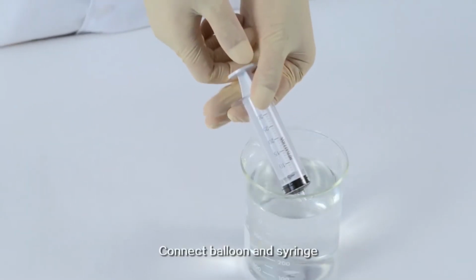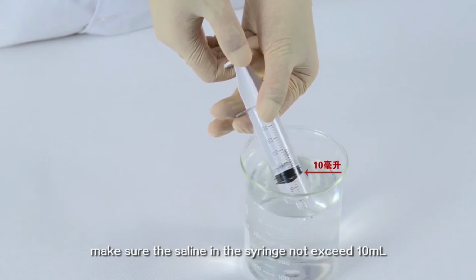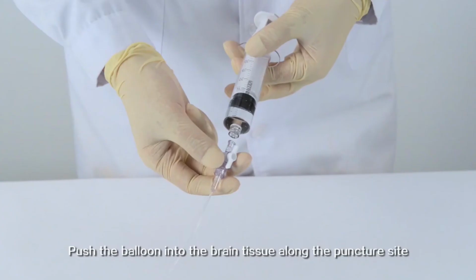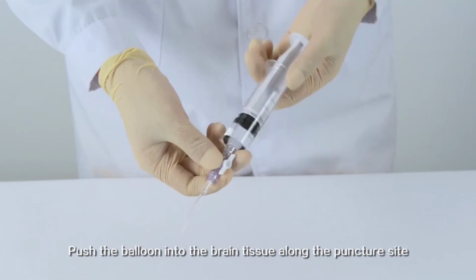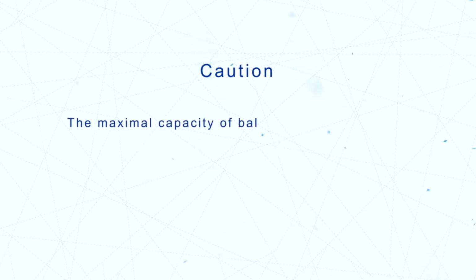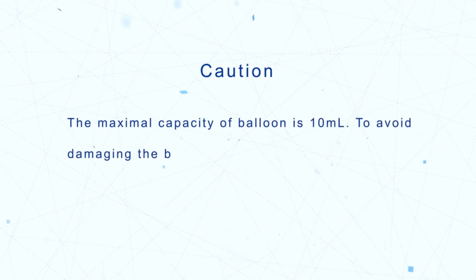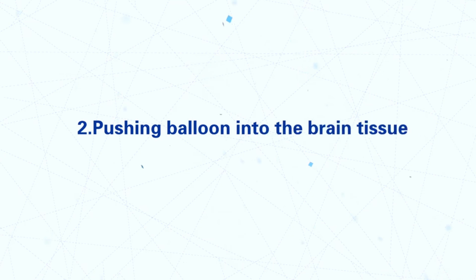Connect balloon and syringe. Make sure the saline in the syringe does not exceed 10 ml. Push the balloon into the brain tissue along the puncture site. Caution: the maximal capacity of the balloon is 10 ml. To avoid damaging the balloon, make sure the saline in the syringe does not exceed 10 ml. 2. Pushing balloon into the brain tissue.